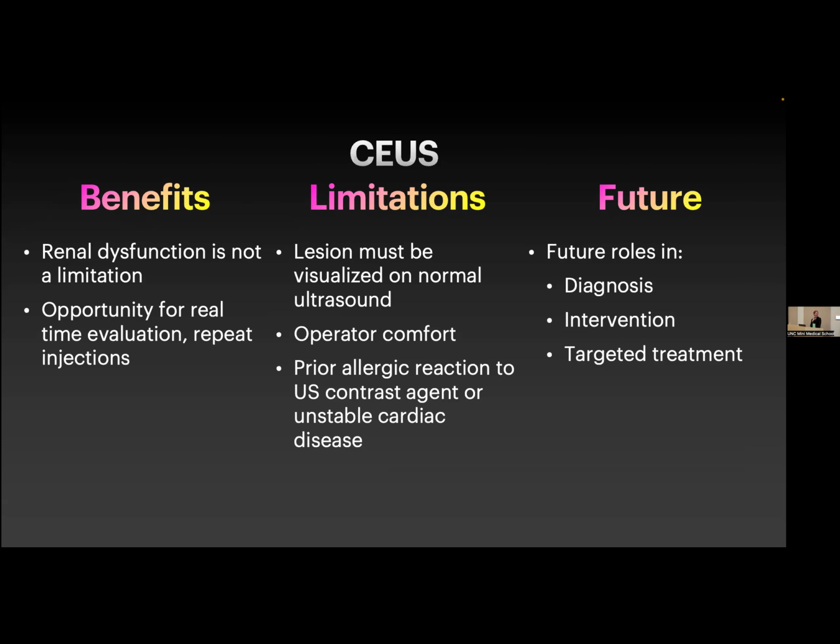So, yeah, question. It has to do with the physics of the ultrasound. We put it on a higher frequency, and so there's more oscillation, and then the bubbles pop. It's asymptomatic. You don't feel it. You don't even know it's happening. We can see it because all that yellow contrast starts to disappear, and it goes back to the gray picture. But there's a way we can do it with the ultrasound without causing any damage to the other structures too. Great question, thanks.